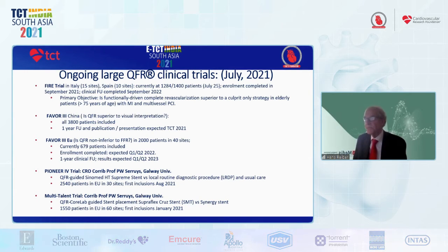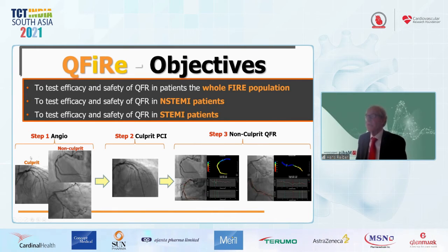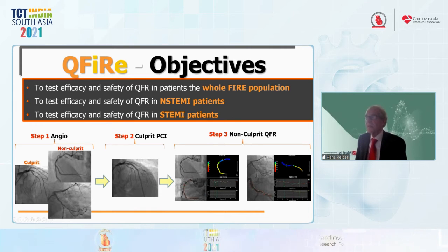60 sites. I would like to show you also a very recent PowerPoint presentation from Professor Campo, where he wants to test the efficacy and the safety of QFR. He now calls it QFire, a combination of QFR and the FIRE study, very nicely found, to test efficacy and safety of QFR in non-STEMI and STEMI patients.